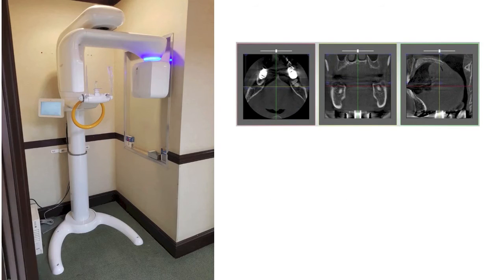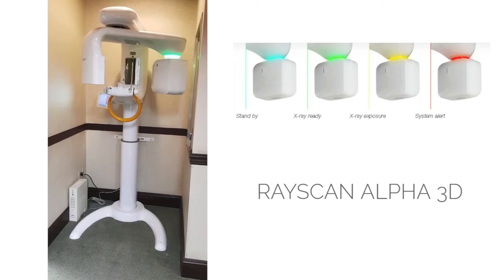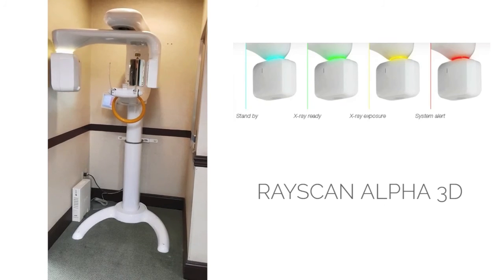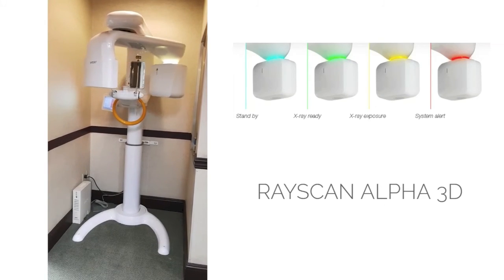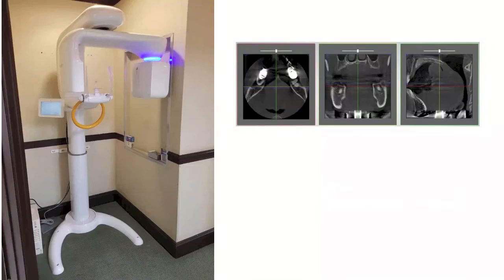So this is what it looks like. I want to show you what it looks like when the radiation is emitted. Okay, you see the light's green now. And now it turned yellow. When it's yellow, radiation's being emitted. You'll see the scan time is about 14 seconds. So it's very rapid, very low dose radiation, a very easy and predictable machine to use, kind of a workhorse. That's the whole length of time it takes. And now it's back to blue, which means the machine's on standby.